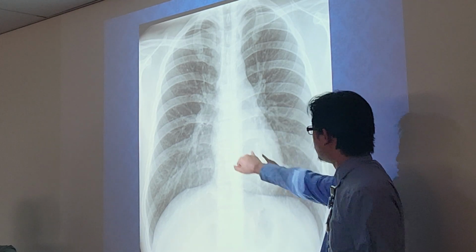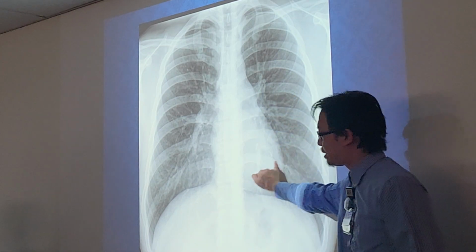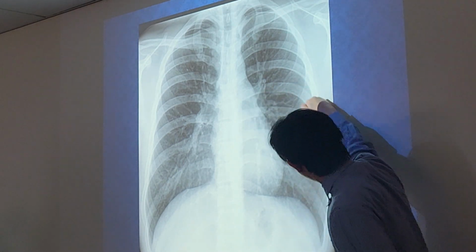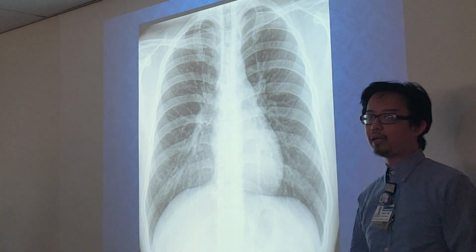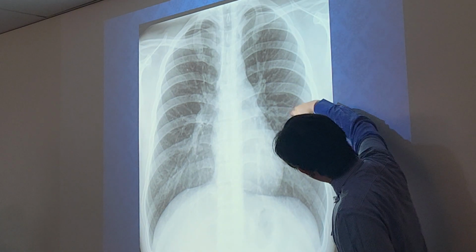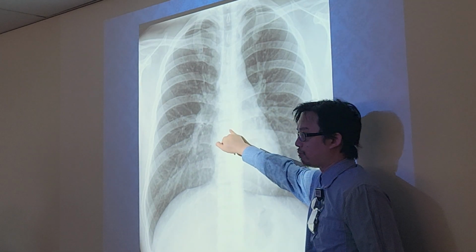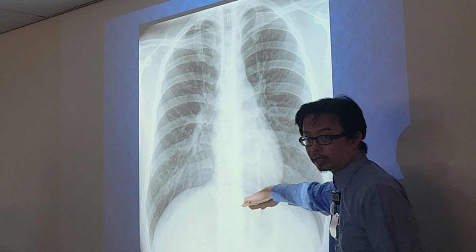Okay, as far as the ribs go, you notice that the ribs curve like this, and then they curve down this way. You've got this nice curve that almost always comes very slightly up and then goes down, down, down. If you are shooting an AP, what usually happens is that this portion where it curves down flattens out. So now it goes like this almost. It's a lot more horizontal rather than curving down vertically.